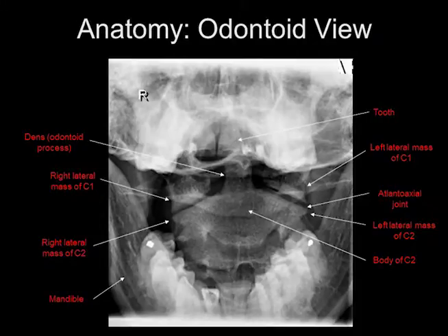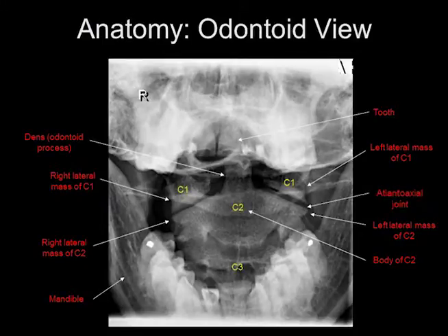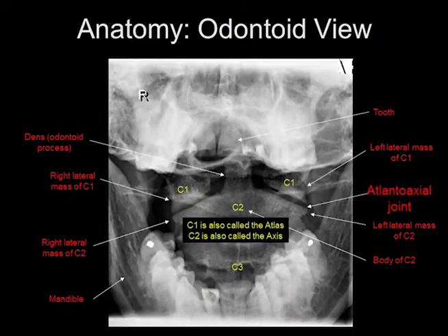On the odontoid view, you can see the teeth. You can also see the odontoid process very well. You can see the lateral masses of C1 and C2. As well, you can see the mandible and the body of C2. You can also see the atlantoaxial joints, which are also called the C1-C2 joints.